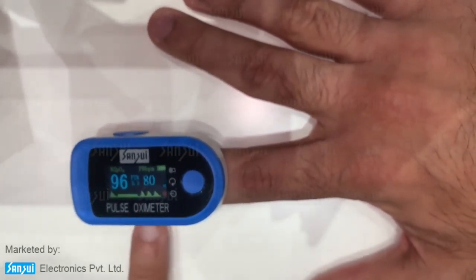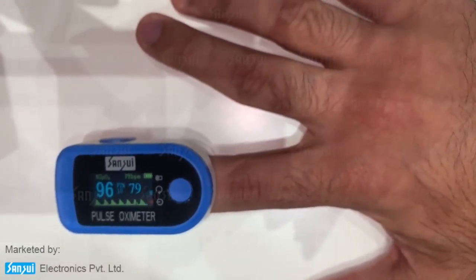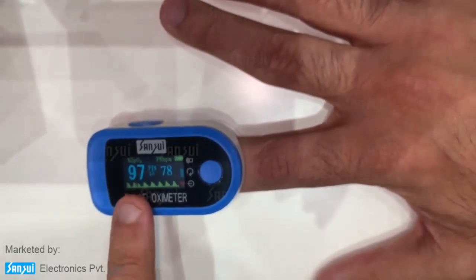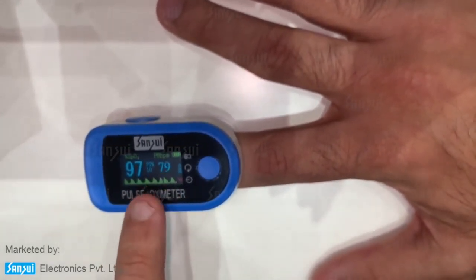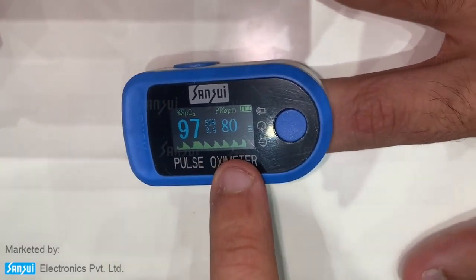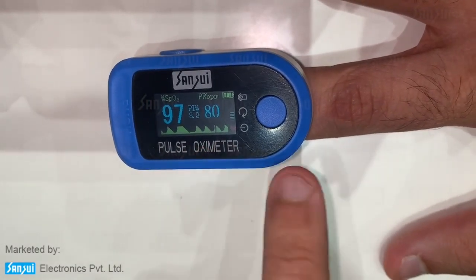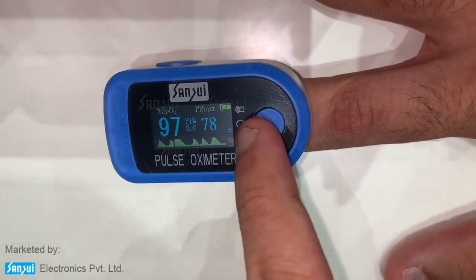The way it works is the sensor inside passes a light through your finger that measures the density of the blood oxygen level. As you can see, 97 is your blood oxygen level, 79 is your pulse rate, and your PI percentage is 9.4. You'll also see the graph of my pulse rate and heart rate on the side.